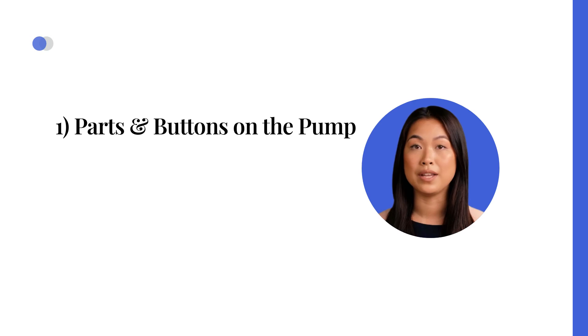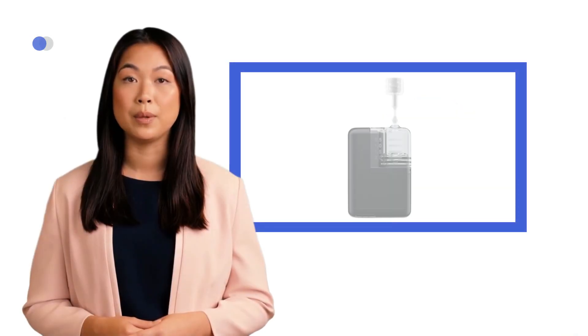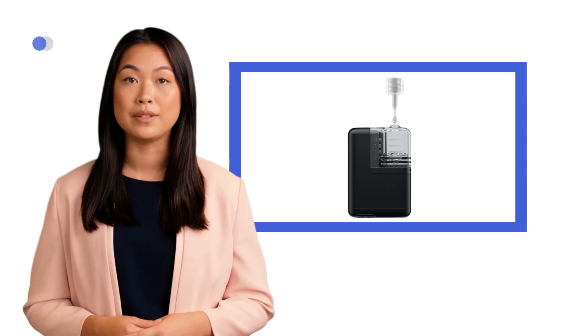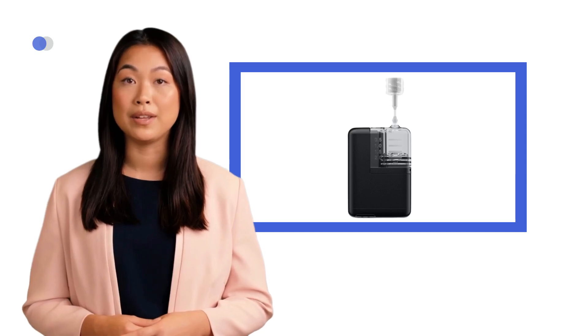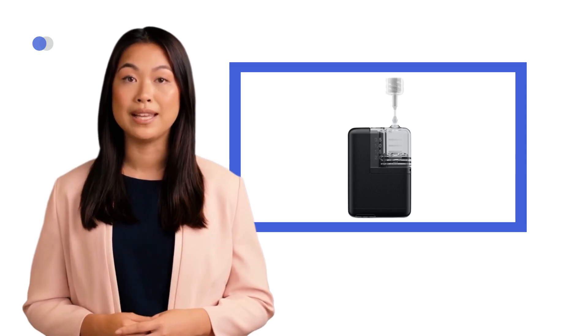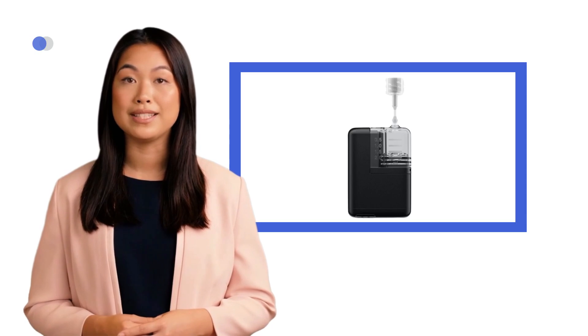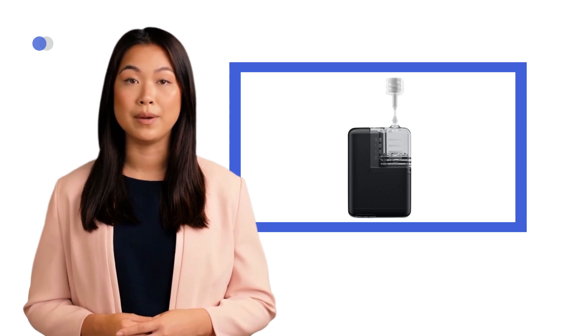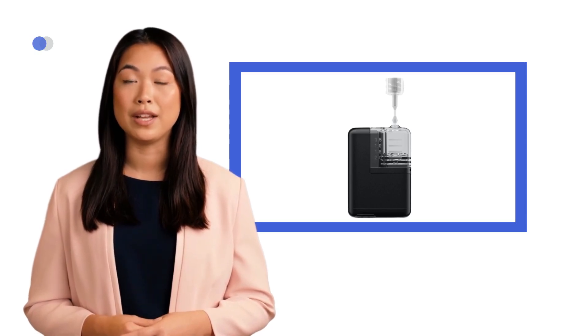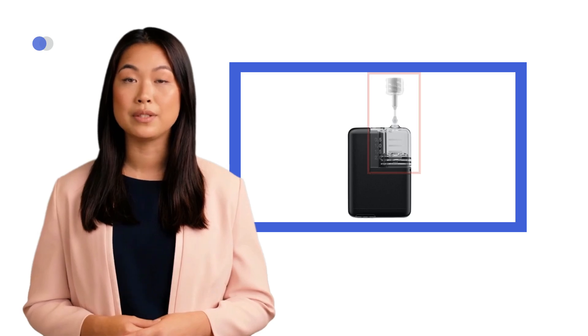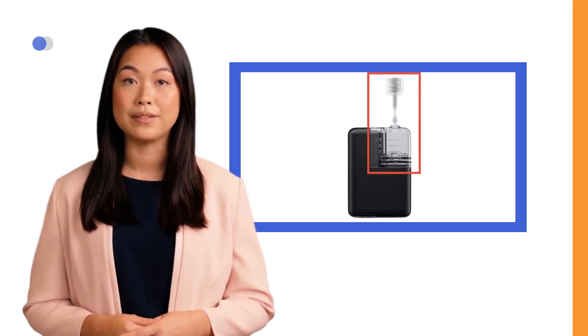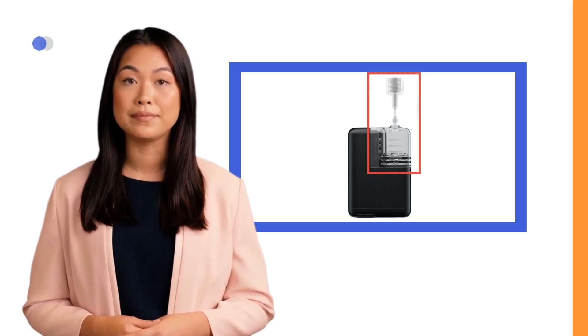Parts and Buttons on the Pump. The Tandem Mobi Pump is a modular semi-patch pump. It has around the same size and weight as an Omnipod pump. It consists of a durable pump base that has a guarantee of 4 years and a disposable cartridge and T-lock connector that should be replaced every 3 days.